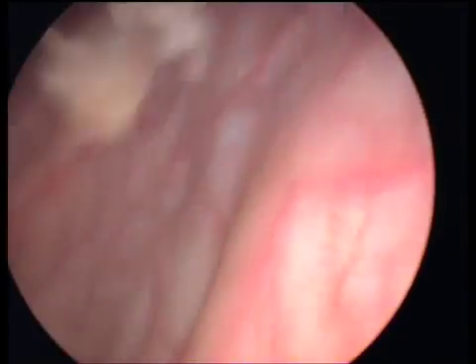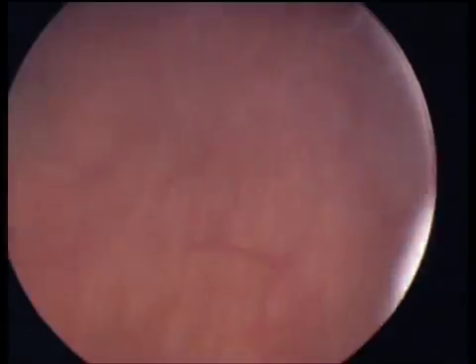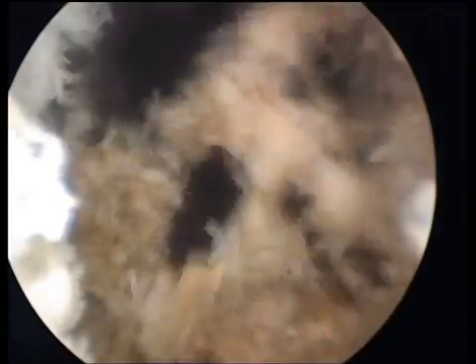Those are little bits of tissue that have fallen into the bladder that will be extracted with a manual washout of the catheter. In these patients I usually remove the suprapubic trocar, place a sticker on the skin, and the catheter is removed the next morning, usually prior to 24 hours, and patients go home.